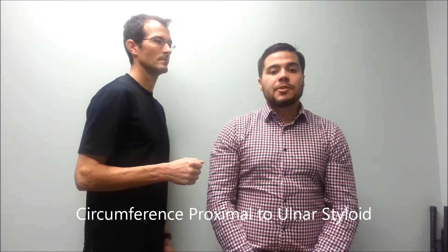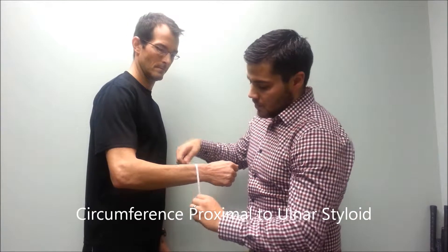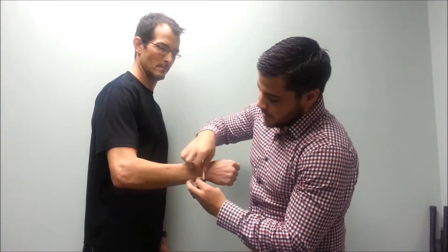Next is a circumference immediately proximal to the ulnar styloid. The ulnar styloid is the bony prominence many people call your wrist bone.